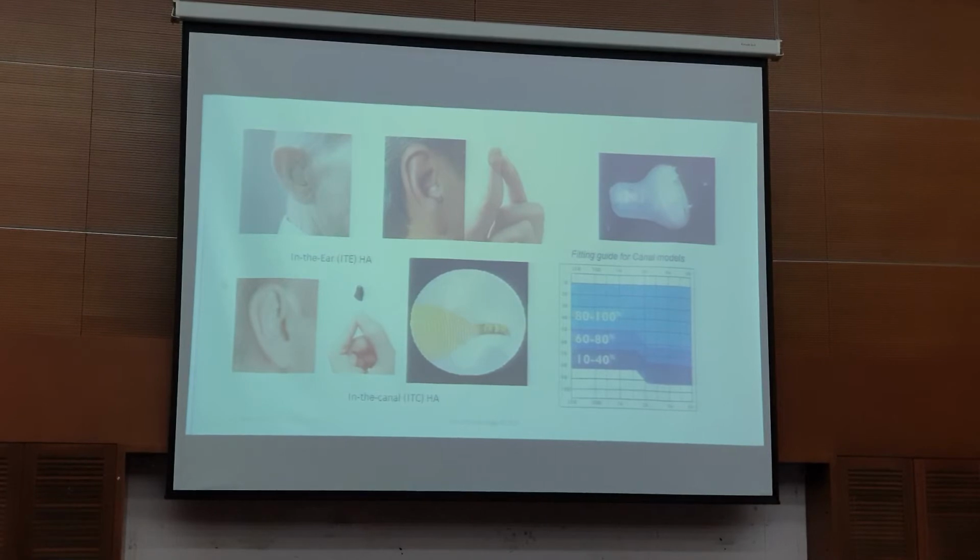In the canal hearing aid, really you don't see anything outside. You don't see the slim tube, you don't see anything. It's very, very tiny. In the canal.